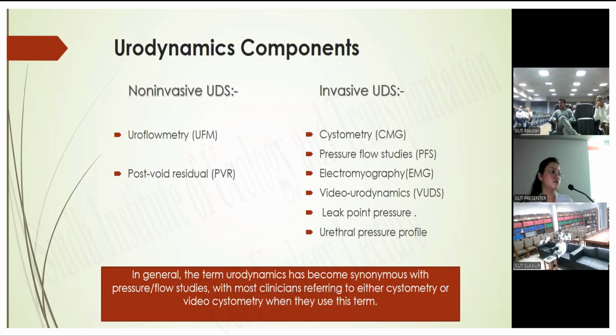We do have electromyography. It is available in the unit that we have, but the problem is we don't have a neurophysiologist with us, so the interpretation of the EMG graph is a little bit out of sync. These things work well when the whole team is working at a different level. If your understanding is coming up to the level of maybe placement of an artificial sphincter, then you would like to do EMG pre-operatively and post-operatively.